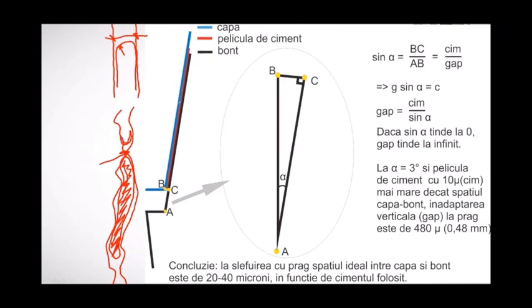Okay, on the other side is a symmetrical and identical phenomenon, right? Because this is just one side of the abutment. So this space, if you remove the red between the two, then the blue contacts the black. But the problem is, where do you have the space for the cement or you don't? Don't try to press it, because it cannot be pressed more than whatever it is, 20 microns, 40 microns. It depends on what cement you have.